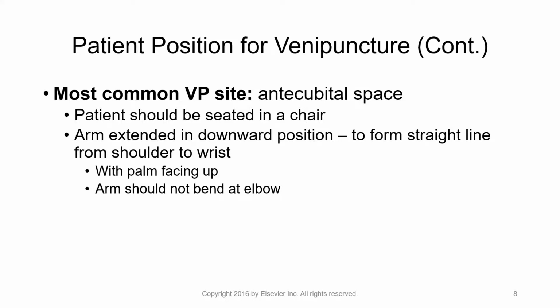We can get to the antecubital space really easily, we can get to the hands easily too, but the veins are not well anchored there, so they're harder to work with. The antecubital space is our spot. The best position is seated.